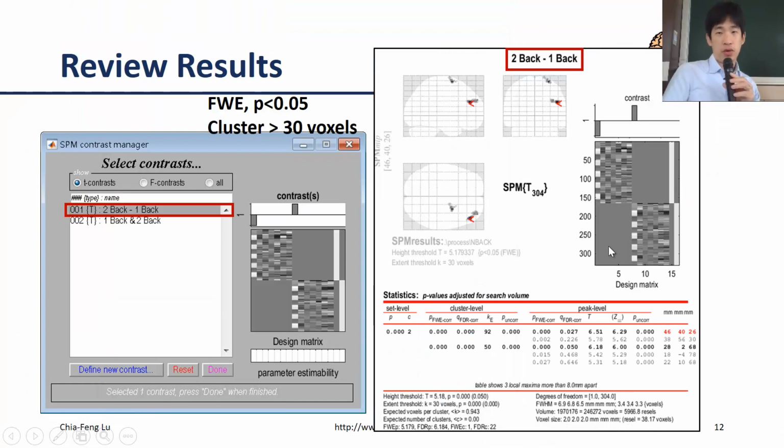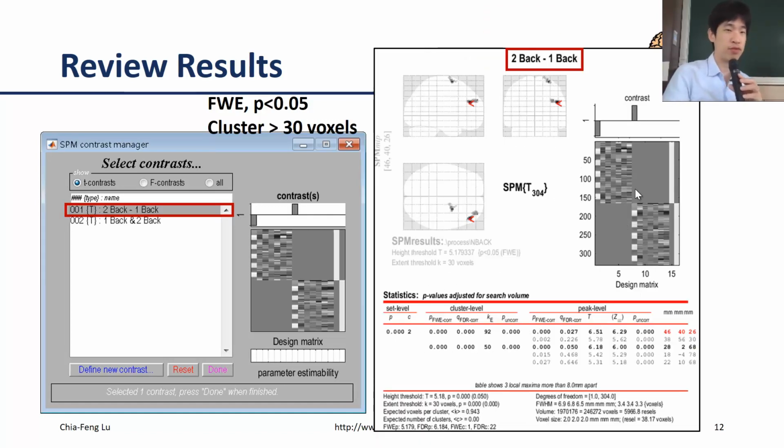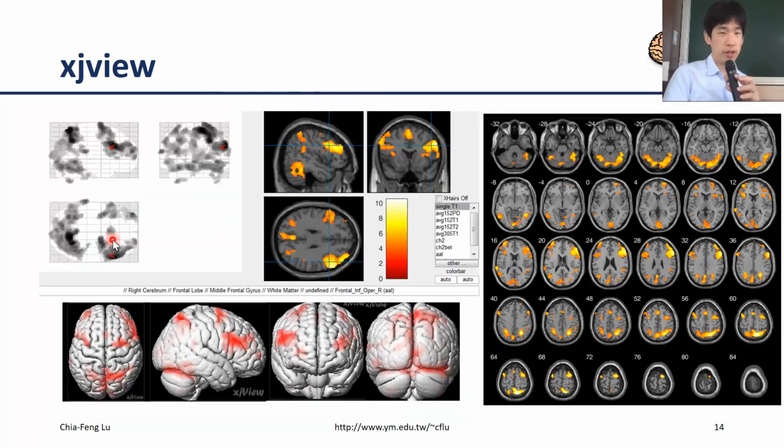Okay, so I will take a 5-minute break right here. Please ensure that you can actually go through different contrasts. You can see in the slides right here, we only set out 2 different contrasts. But as I displayed on the screen previously, you can actually design several different contrasts depending on what your question is. Okay.